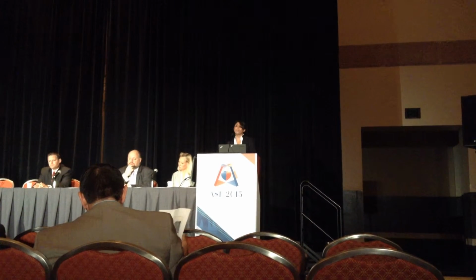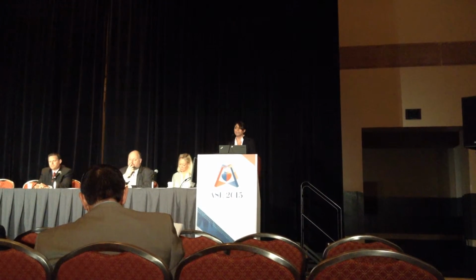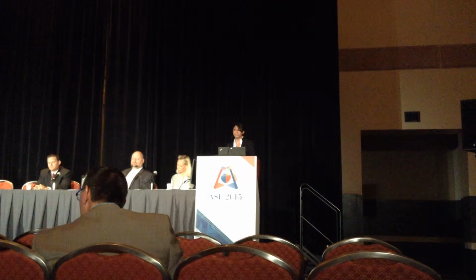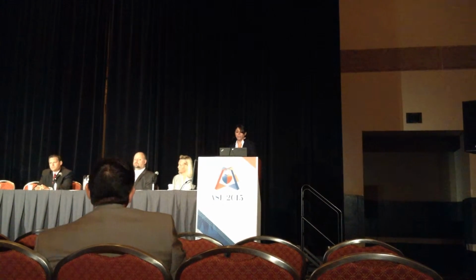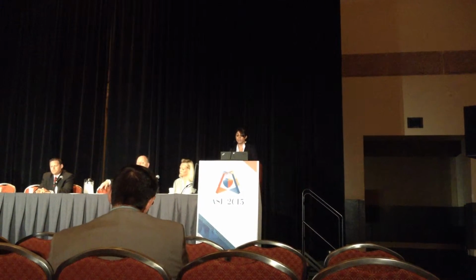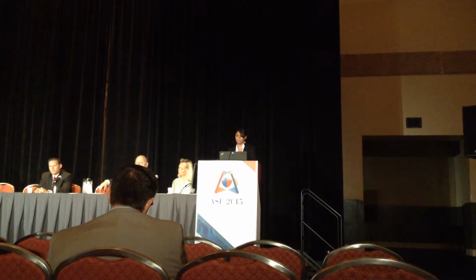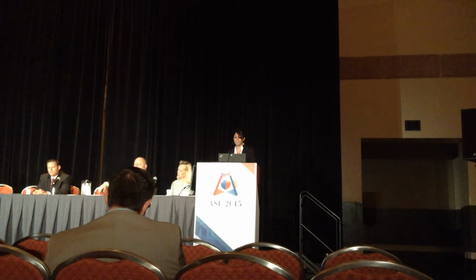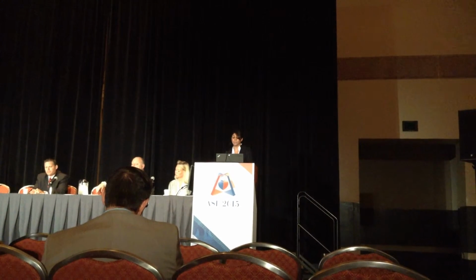Mitral regurgitation, we need to quantify this, because anything greater than mild mitral regurgitation is a contraindication to percutaneous balloon commissurotomy. And also right heart disease. What are the pulmonary systolic pressures? Because if you have a tricuspid annulus greater than 40 millimeters, this is a reliable predictor of severe TR developing late after surgery.